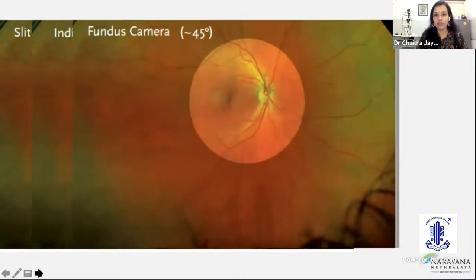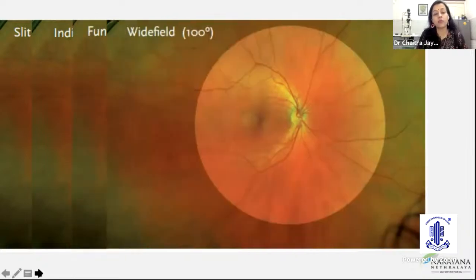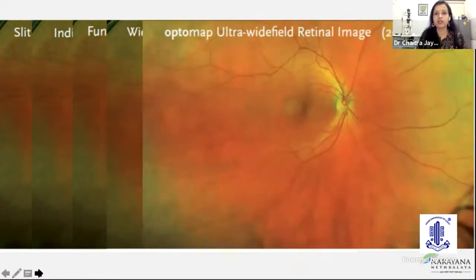And then you have your fundus camera. This is our regular fundus camera that we use, which gives us about 45 degrees. And then you have to take multiple images and montage them together. Then we went on to 100 degree fundus cameras, which gave us a little more view, where you see a little beyond the posterior pole and the arcades. But then came the Optos, which is really ultra wide field imaging. And this gives us 200 degrees at one view. And like Dr. Debdulal mentioned, we can't see ora to ora, but you can see at least 80% of the retina. And once you steer the eye and you ask the patient to look up, down, you can actually manage to view the entire retina, if not in one single image.